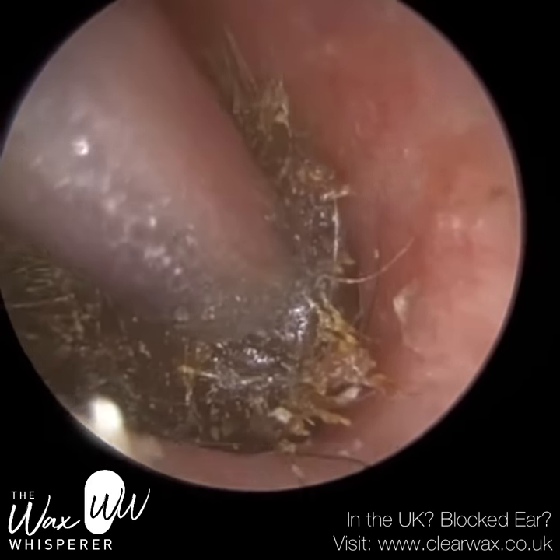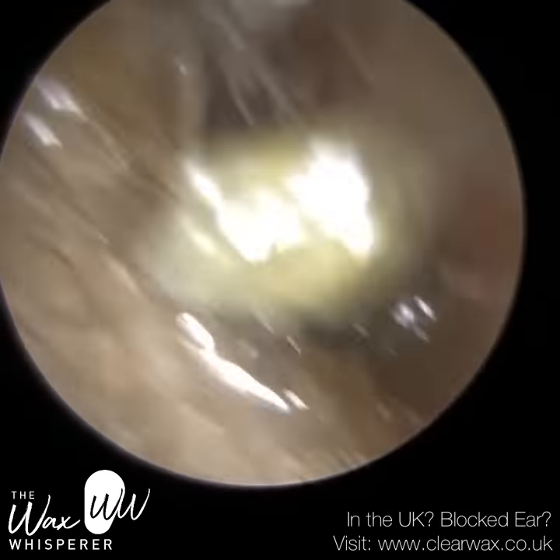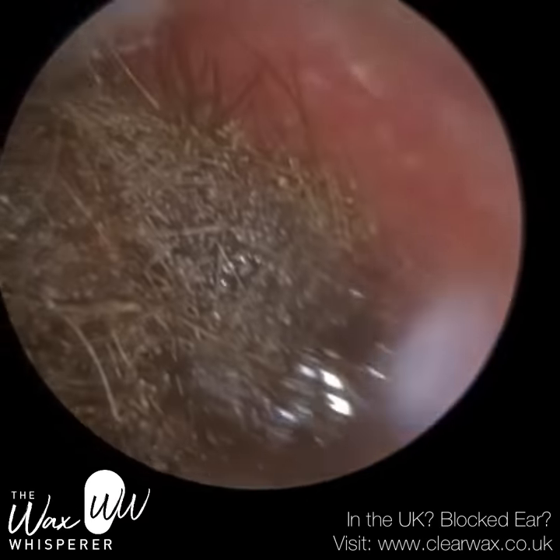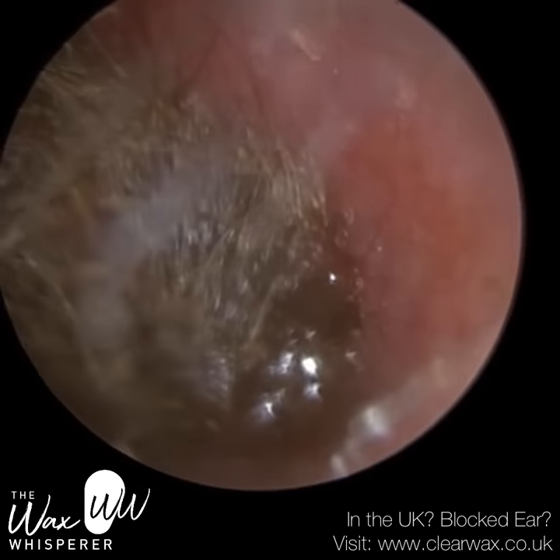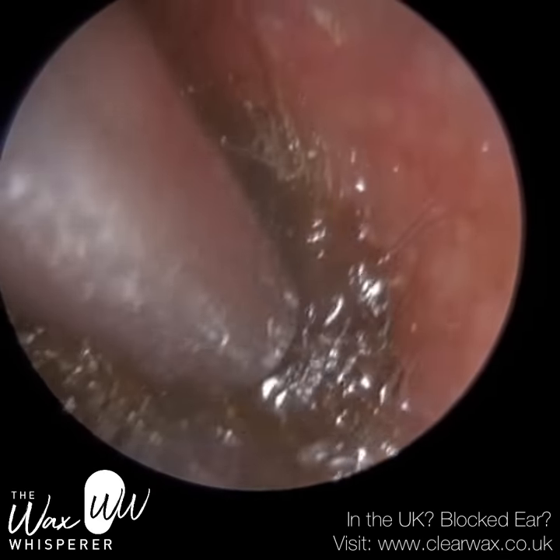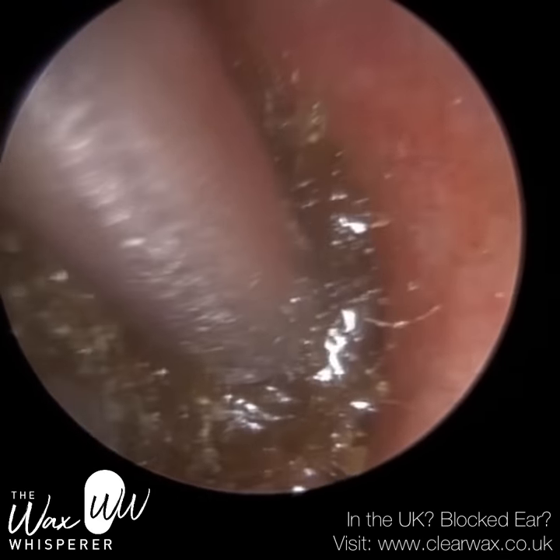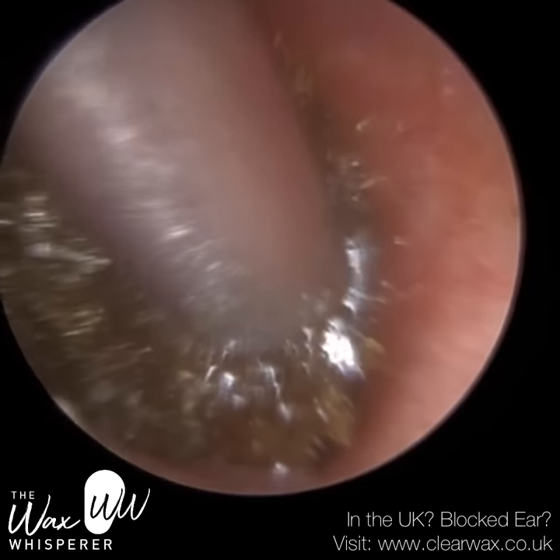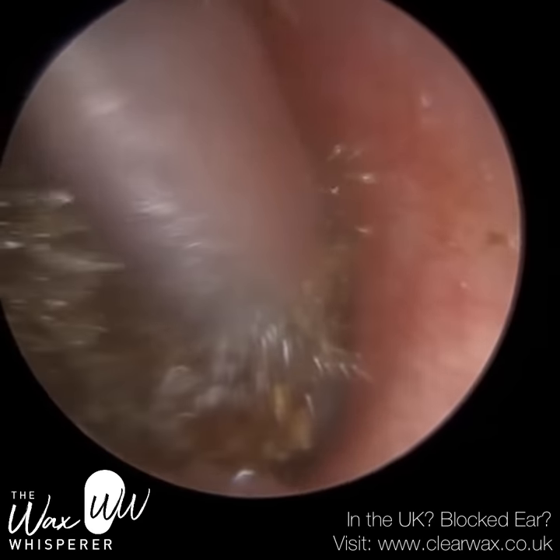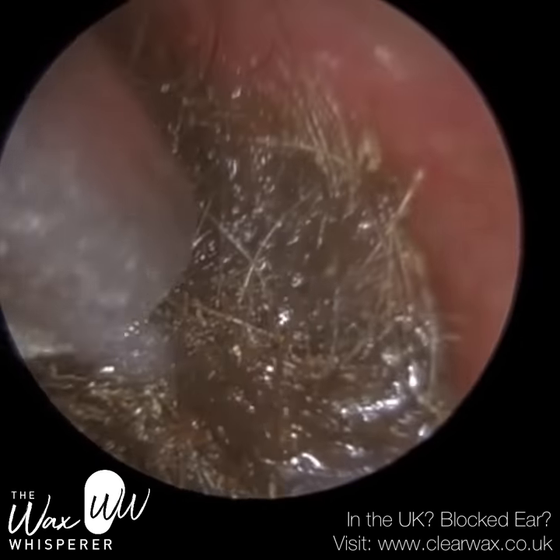I'm just kissing the surface with the suction. We've got to be careful — when you don't get a suction grip, sometimes you can force the sucker too much against the wax, inadvertently pushing the wax further in and compressing it against the eardrum. So you've just got to be very gentle. That's why I've applied some olive oil medical spray, just to lubricate the ear canal walls and soften the surface of the wax just enough to get a better suction grip.